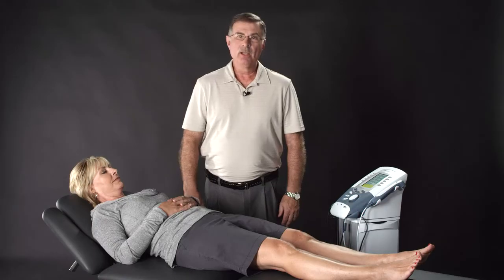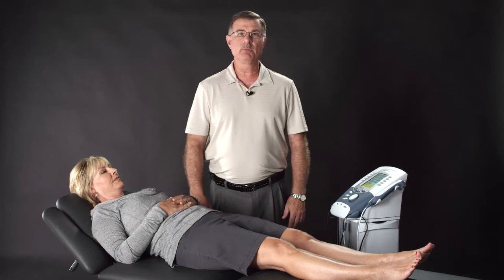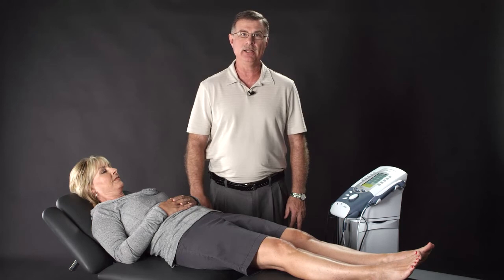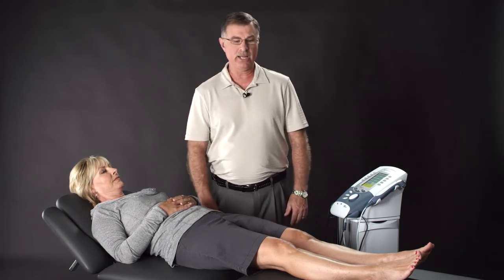Now let's demonstrate how to use the pre-modulated waveform to treat pain in our patient's knee. For irregular areas or smaller areas where it's difficult to place 4 electrodes to get the interferential effect, we can now use pre-modulated. Pre-modulated only requires 2 electrodes and 1 channel.